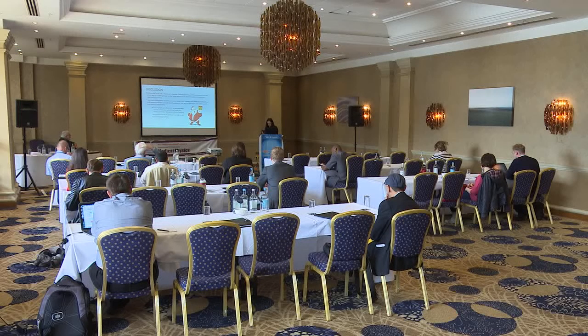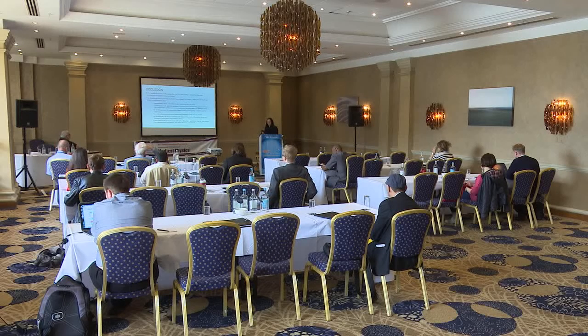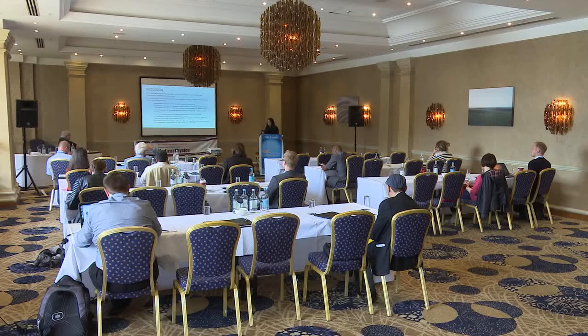But for a single practice, it is recommended to use reference levels that have not been corrected for the body habitus, as they would be more representative of typical local practice. And established local DRL values for ERCP in the study become a tool for the daily follow-up of patient radiation doses in our hospital.